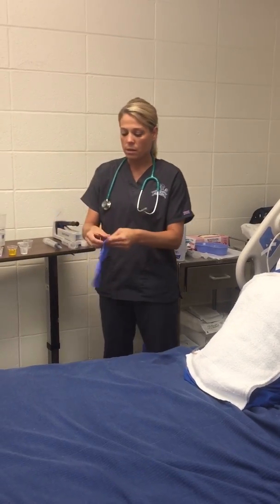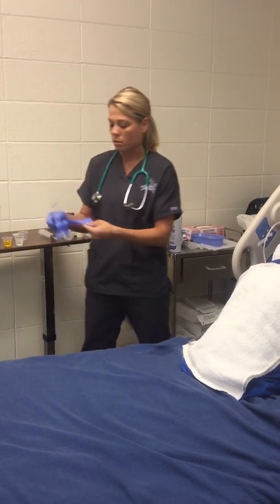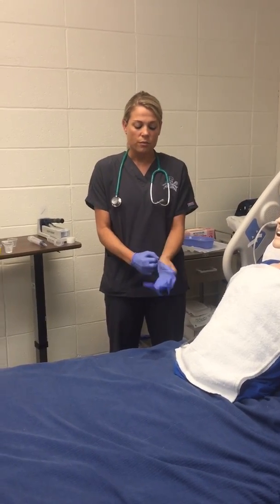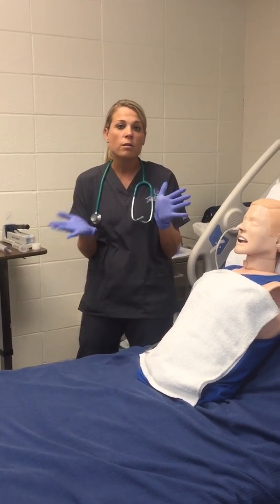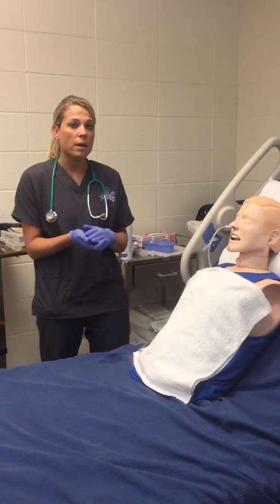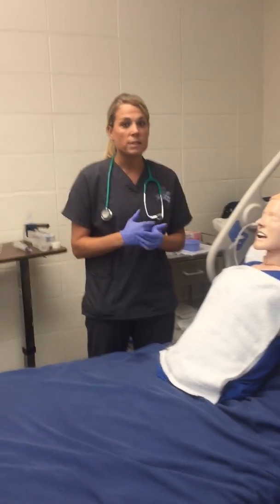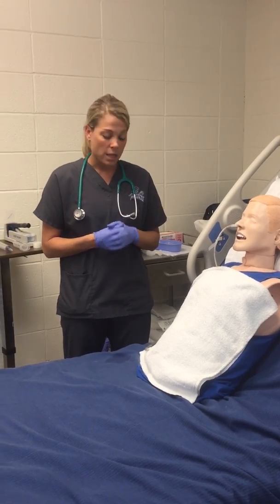Next, I'm going to go ahead and put some clean gloves on. And the first thing I'm going to do is check placement of my tube. Like I said earlier in the video, one of the ways you can do that is by instilling 30 mils of air into the NG tube, listening for the swish sound in the belly. So yes, we are in the correct place.